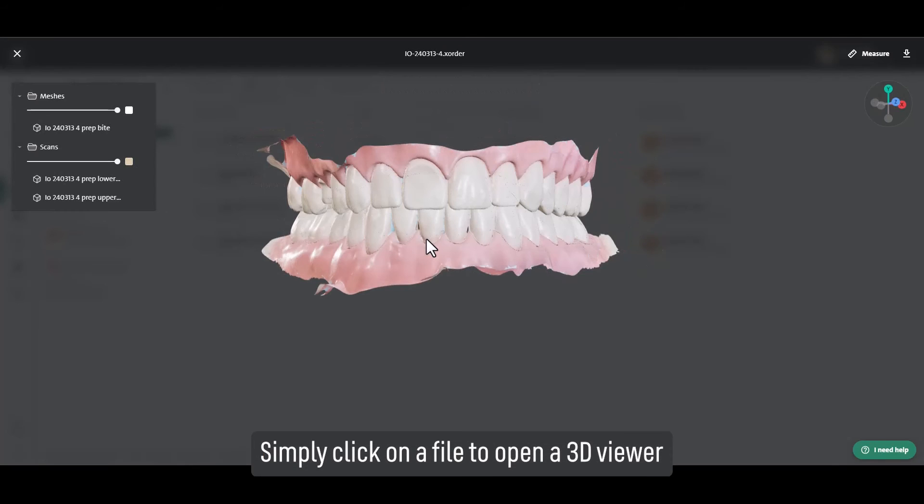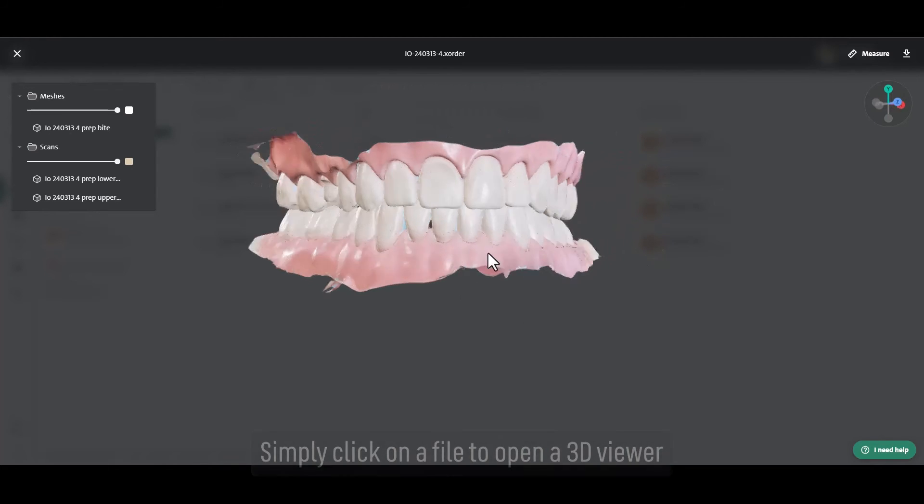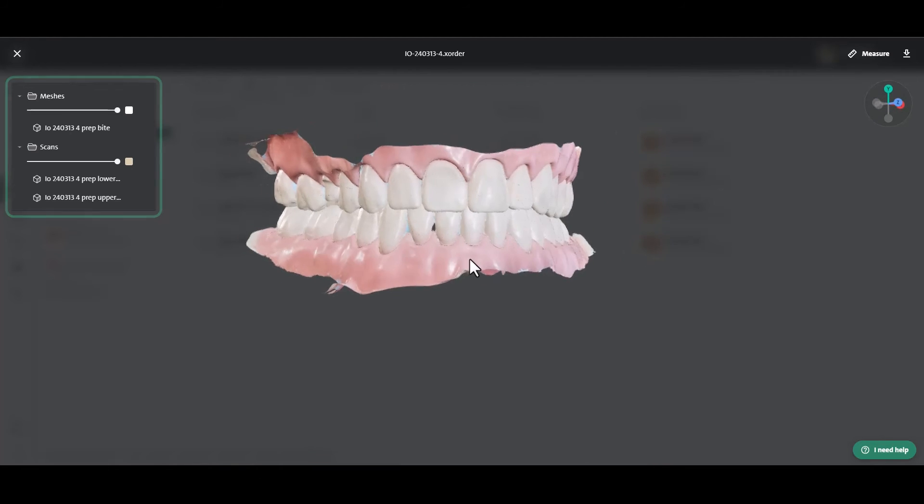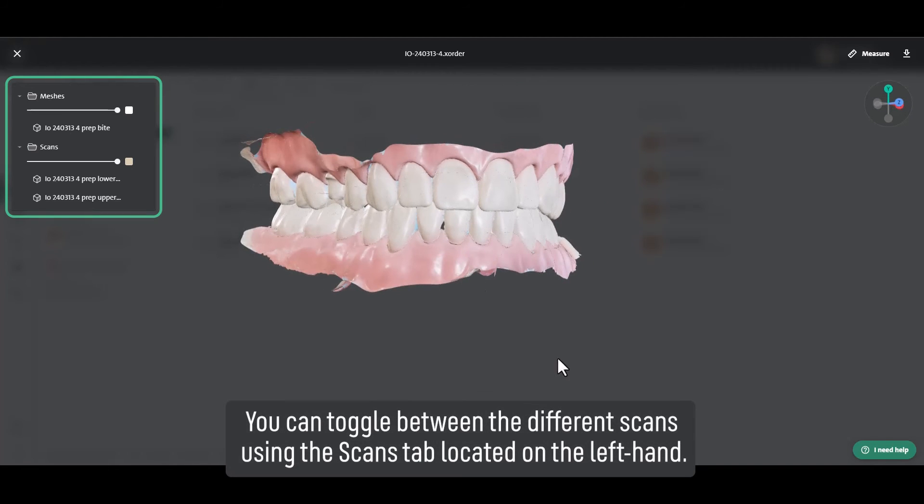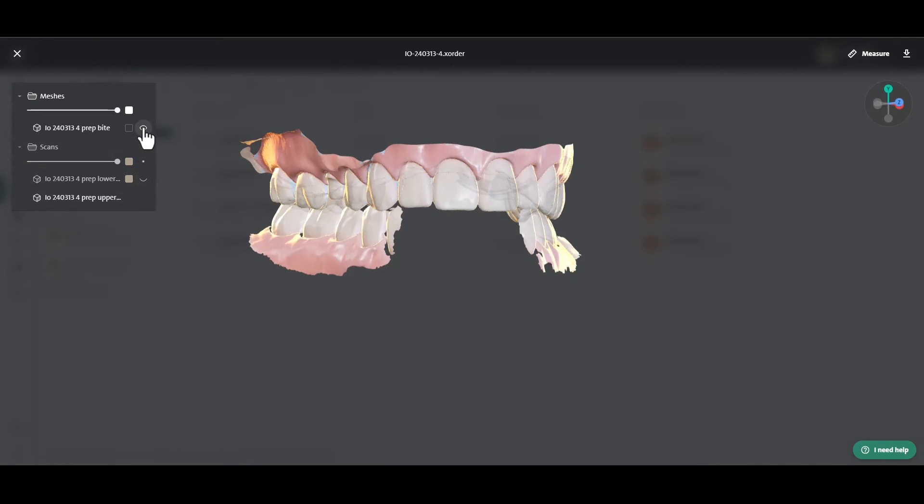Simply click on a file to open a 3D viewer. You can toggle between the different scans using the scans tab located on the left-hand side.